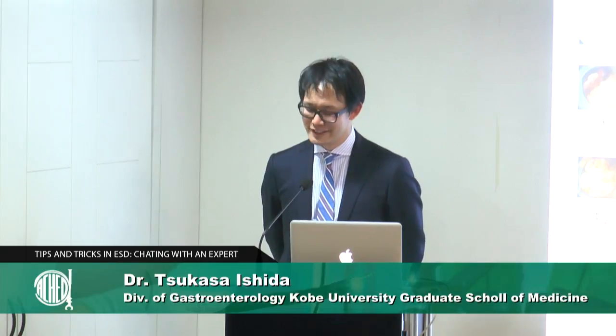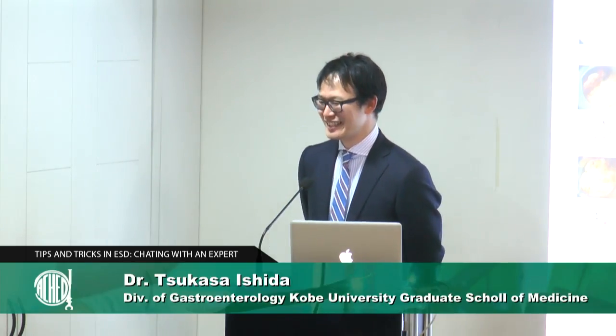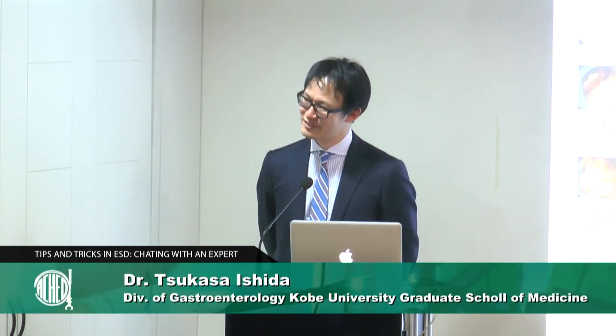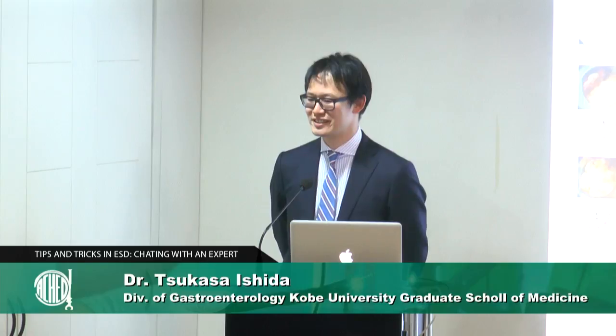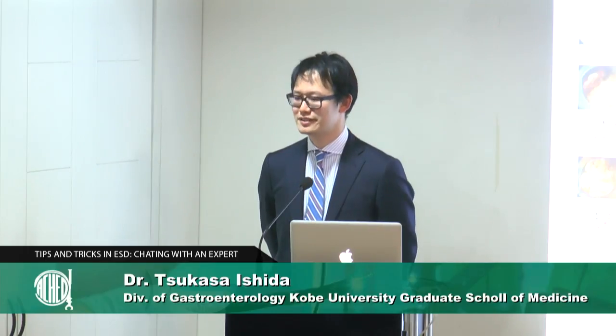I'm sorry, but it's very important for us in South America. So if we invite you to a live here next year, and we don't have MucoUp and we have a non-granular type LST in the transverse colon, would you be willing to use Voluven or glycerol, or would you ask for us to have MucoUp for that kind of ESD procedure? If I have an offer like this, I would try ex vivo models before the human procedure. I try to check which solution is better. So definitely, it is very much recommended to have MucoUp for colonic ESD. Yes, I think so.